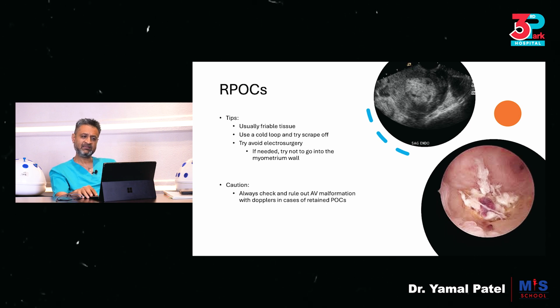Unless these retained products are actually stuck to the myometrium, meaning an accreta format, I don't think you need energy to separate them off.